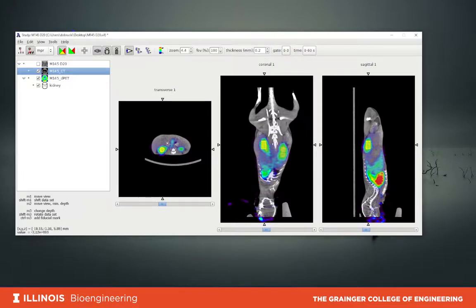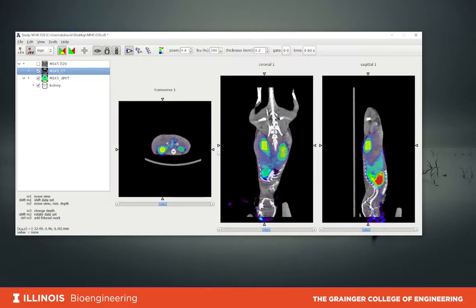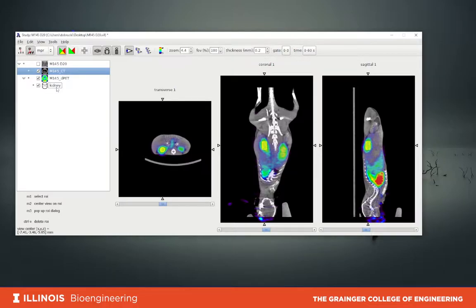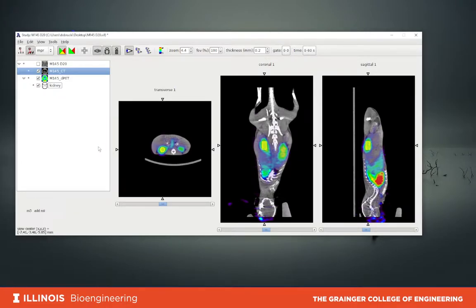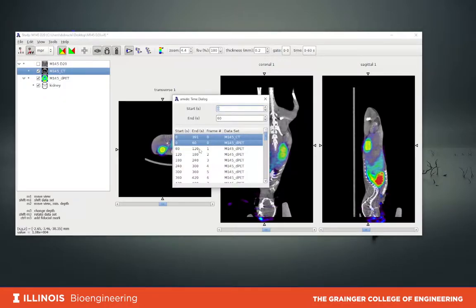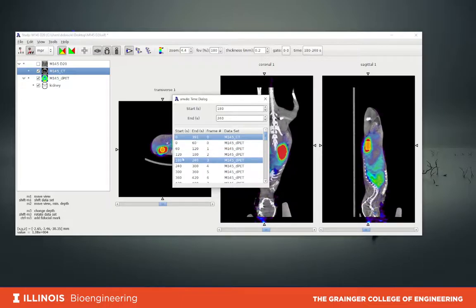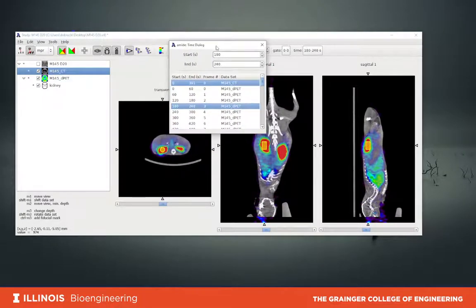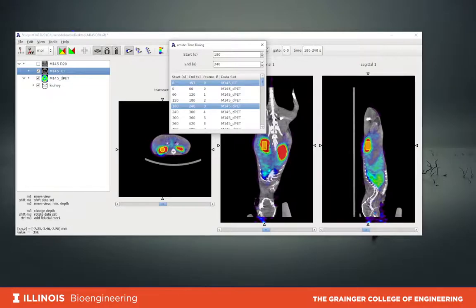We can also click and move the region of interest to make sure we are within the kidney tissue on all three cuts — transverse, coronal, and sagittal planes. We can see the region of interest is within the kidney. Now we can calculate what the activity of the kidney is versus time. Because we have 60 frames, we can change to the second frame, the third frame, and so on — the regions of interest are still present and defined, but will show different activity.